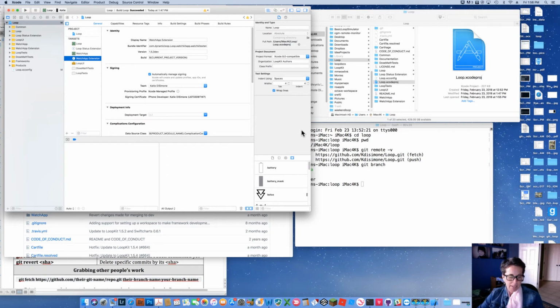And it's merely saving the files. So if I go up to save, it's not really the same in Xcode as it is when you're working in a Git directory. If I do a Command S, it doesn't really save the same way. What it is called is a commit. For Git, a save is like a commit. Or I should say a commit is like a save. But think about it like committing it to memory.